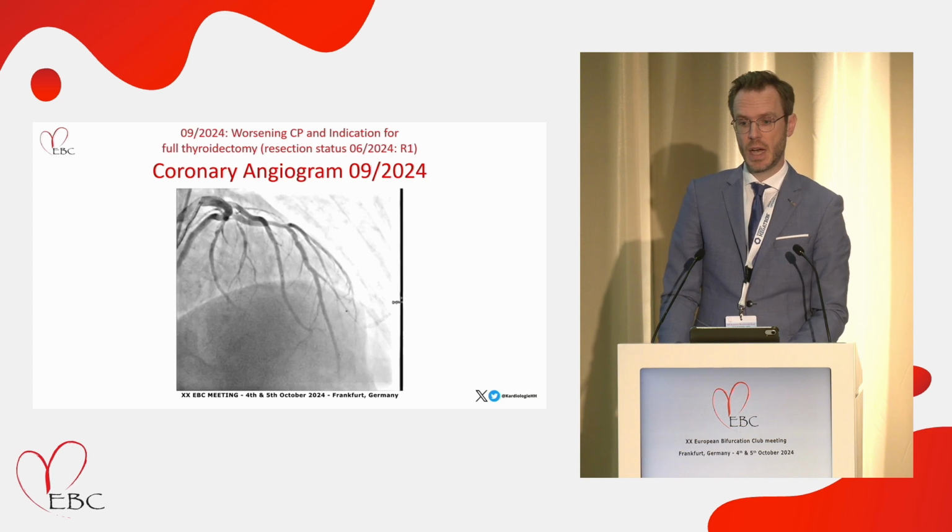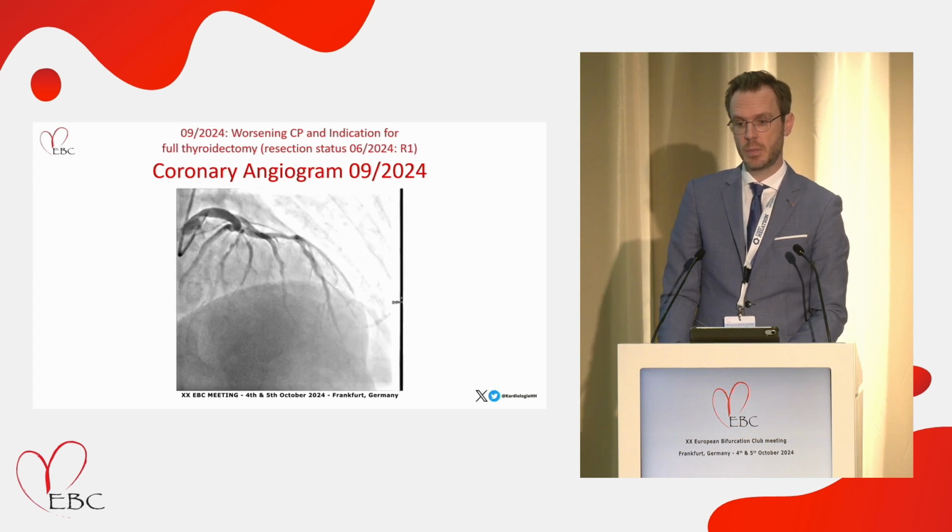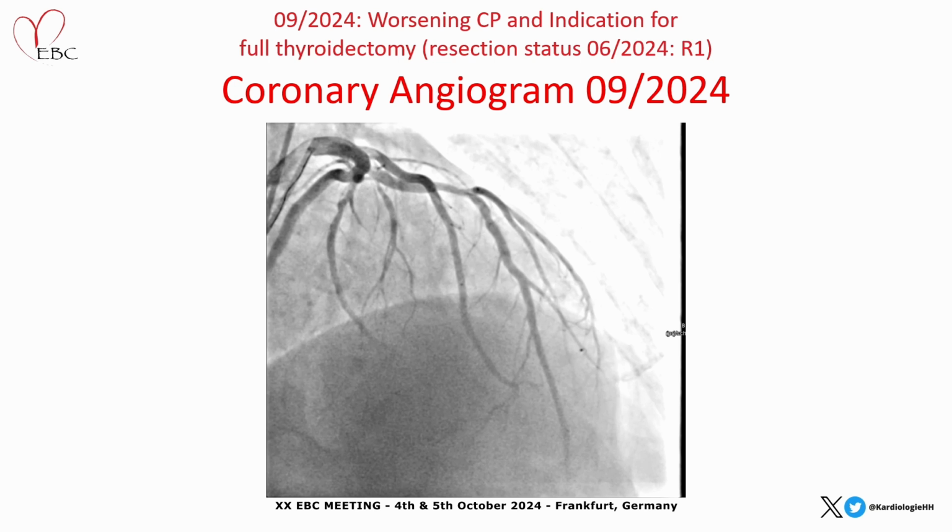This is how the angiography looks. It's running a little bit slow. It's not TIMI 1 flow, trust me. But you can see here with the guiding catheter inserted that there is still a diffuse lesion before the D1 takeoff and a diffuse lesion after the D1.